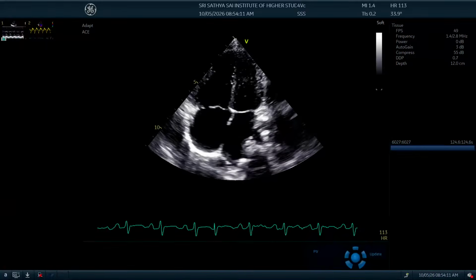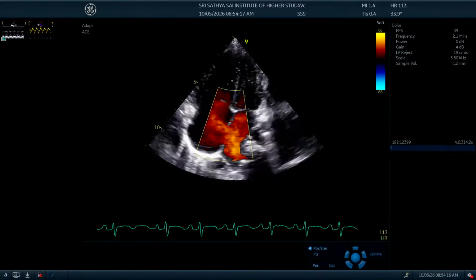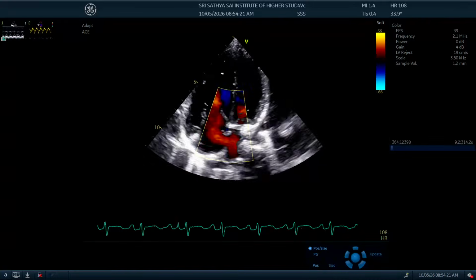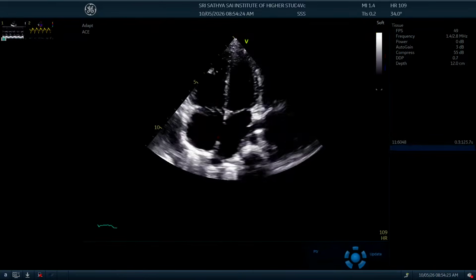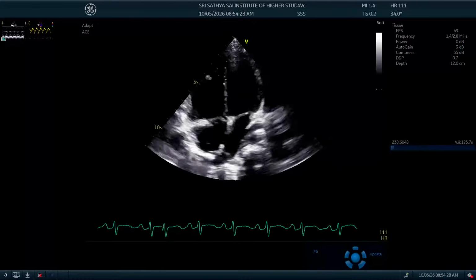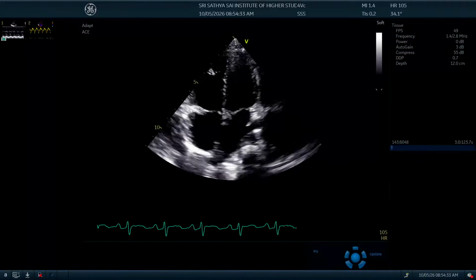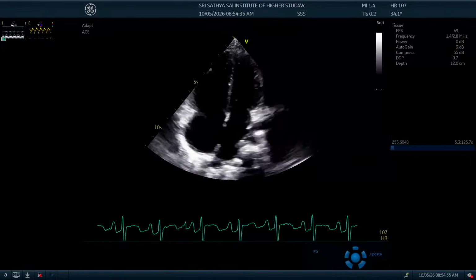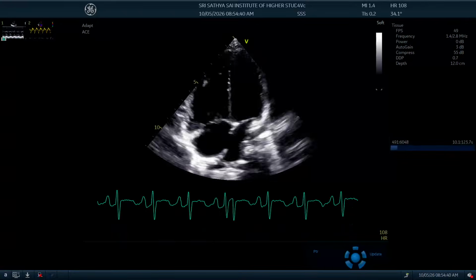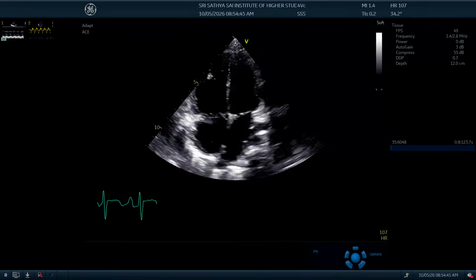Yes. Now what I want you to see is first degree AV block. Whenever you're doing an echo, your eyes should be on the ECG, not just on your image. You see there is a first degree AV block. There's a PR interval that's prolonged, and that happens because the RA is stretched out. You should be careful in this patient to put a device, because your device might impinge and actually increase the AV block, or even in a surgical case. You see there is a huge difference. We can see how big the PR segment and PR interval is. But always be mindful that the image is also a human being.